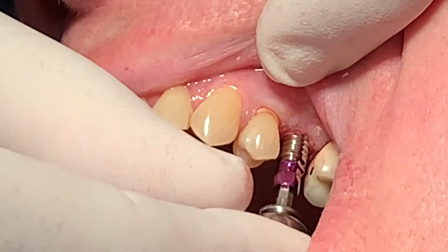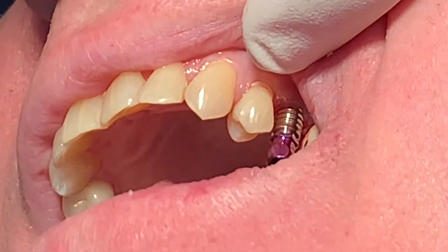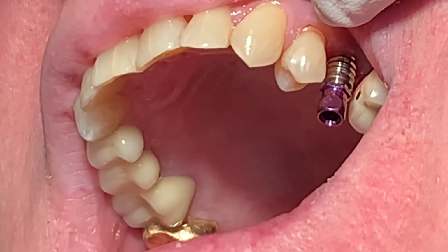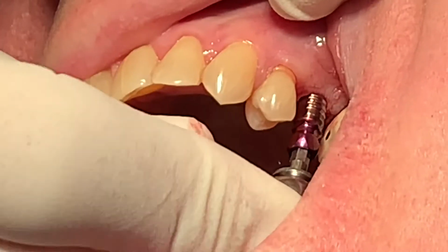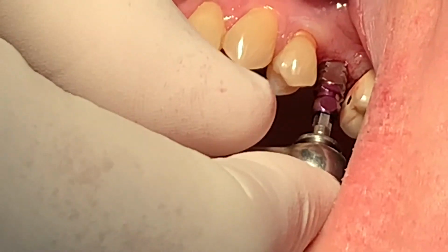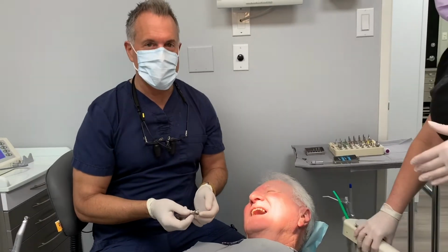You gotta get the flat part of the labial. I think so. Open for me. I do want the flat parts of the labial, but I don't have x-ray vision, so I'm going to need a mirror. Or to the lingual. It's on the lingual. It's maybe a little clockwise, so let's back that off. I do have a torque wrench. Okay, good. Okay, you want me to stay there? No, a little more. Good. Okay. All right, so let's take an x-ray. Okay, you're on. Ready? Yeah.